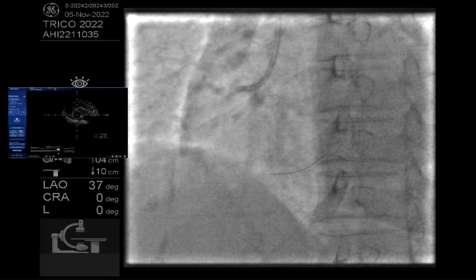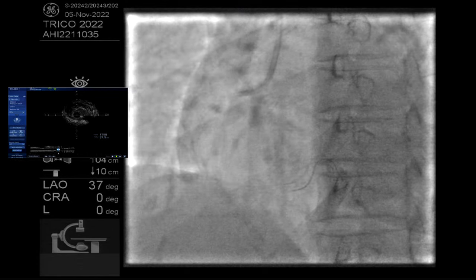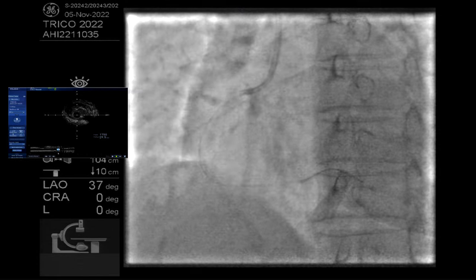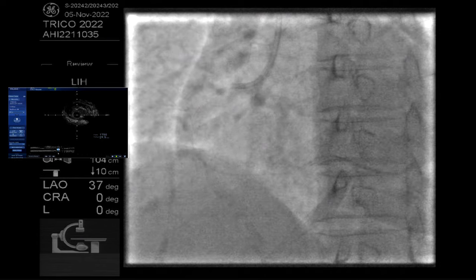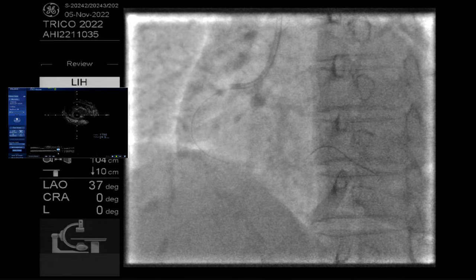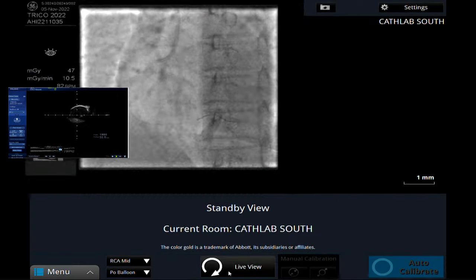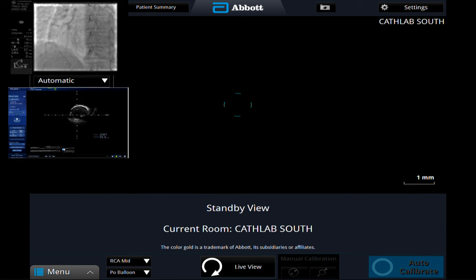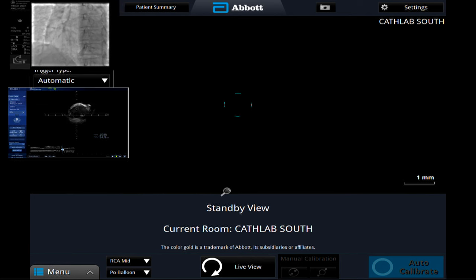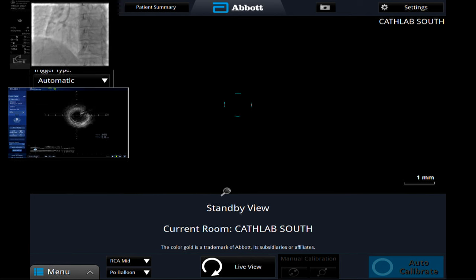Now I am putting the OCT. We will ask them to run both OCT and IVUS simultaneously on two screens, and I request Dr. Akasaka to give commentary when they are being run simultaneously.